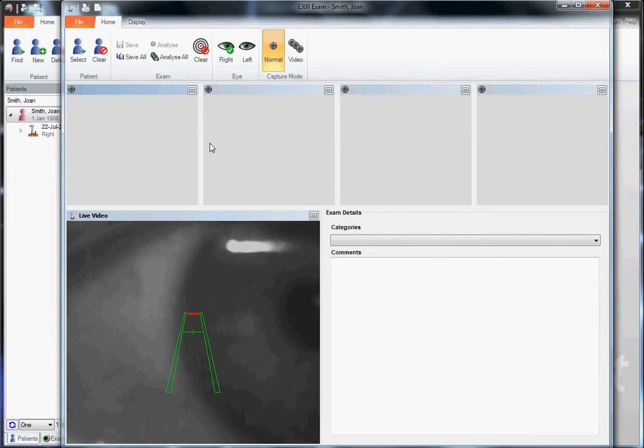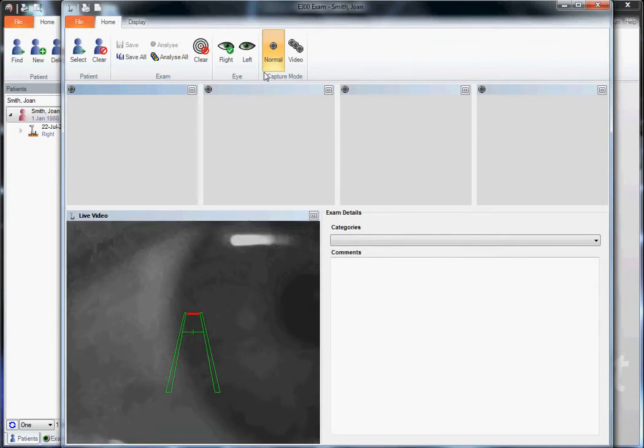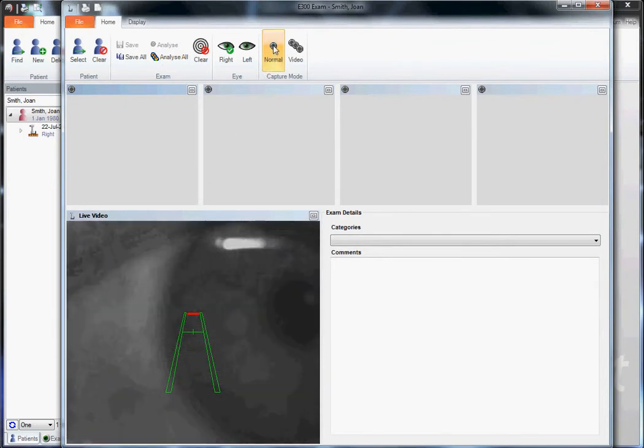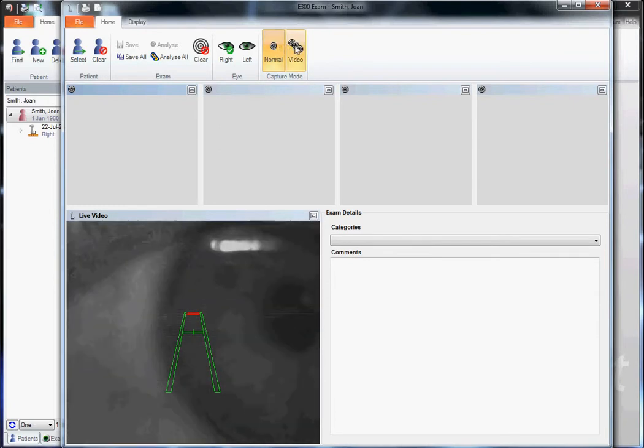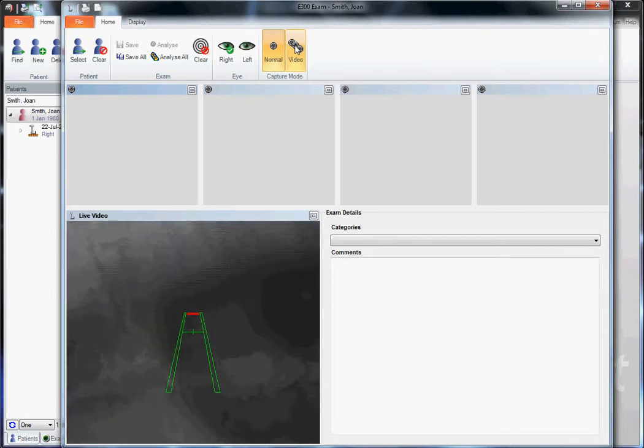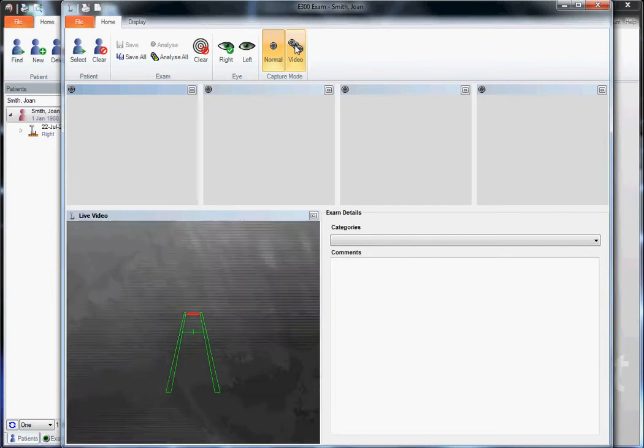Once the capture window opens up you have the option for normal topography capture, a single image, or you can go to video capture. Use the video capture when you're assessing dry eye.